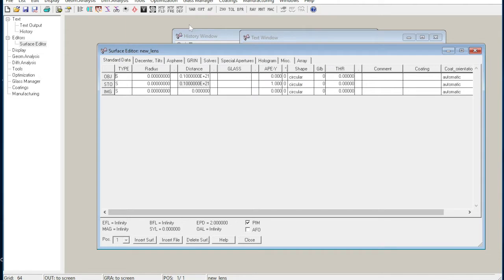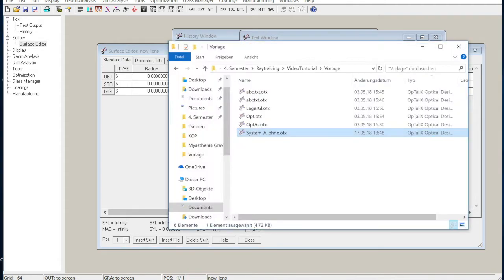Welcome to our video tutorial about the program Optalix. What we're going to look at is how to optimize an optical system. In our case, the system is an eye and a spectacle lens. Therefore, we need an eye.